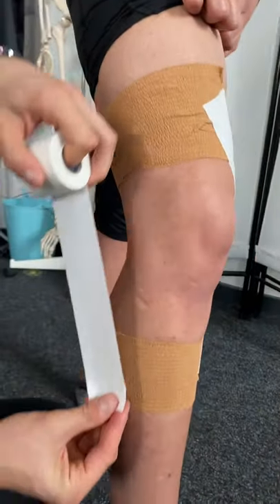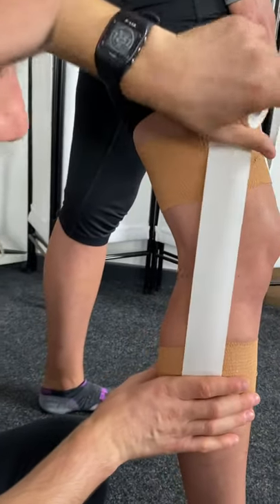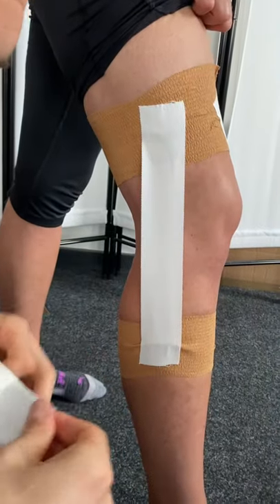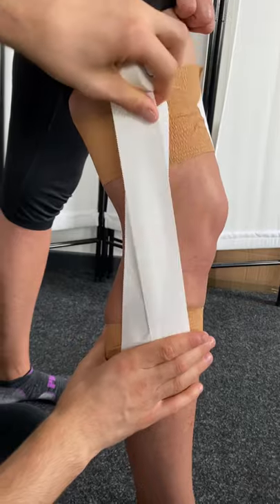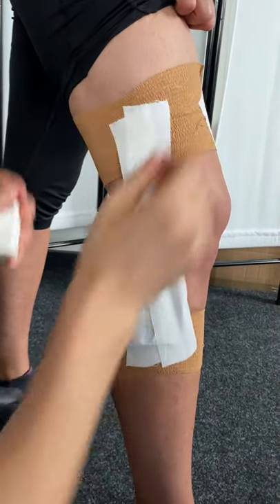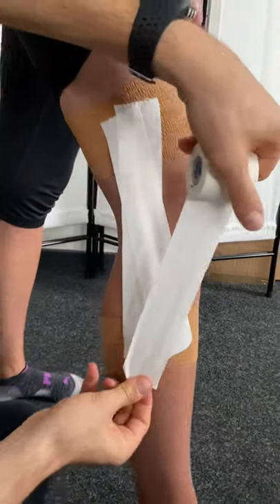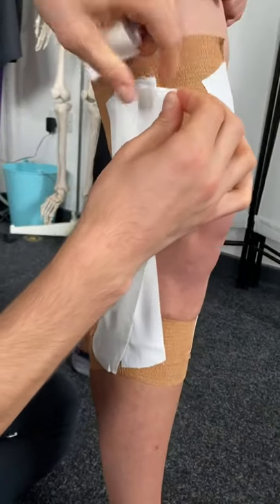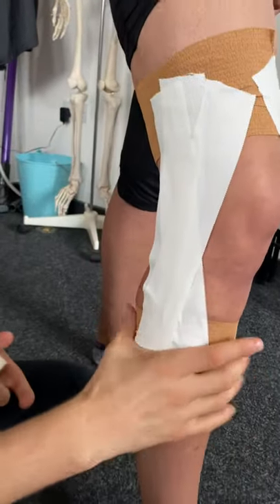We're going to try and cover this LCL in three dimensions, so we'll go one straight up and onto the anchor. We'll do another on an angle coming more to there, again trying to avoid closing the back of the knee and also having an effect on the kneecap. Then we'll go one a little bit more towards the front, up and onto there, and then secure that with another anchor with EAB.